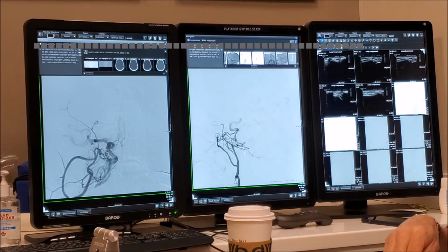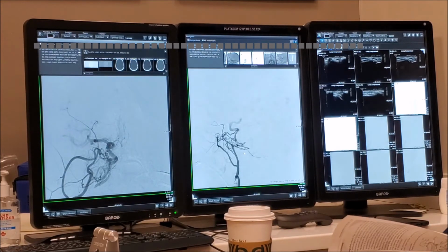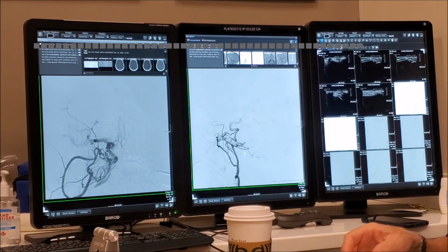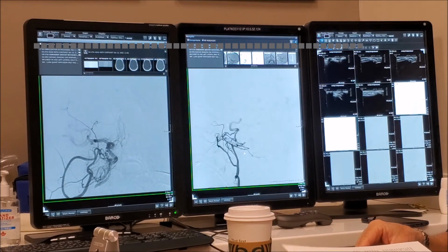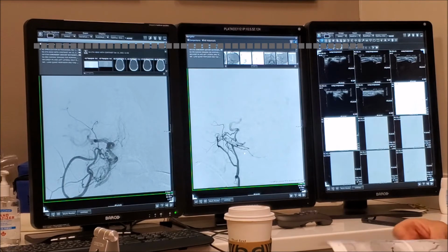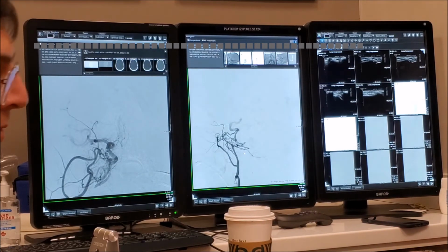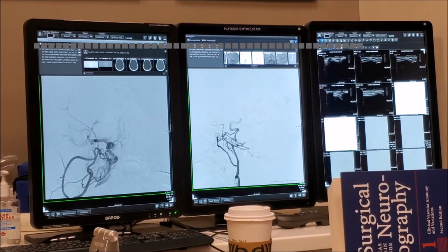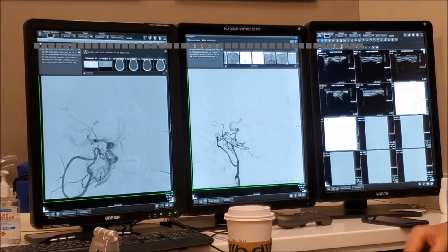Okay, no, but seriously, in here there's something, we're gonna be able to figure this one out. So the question was the stapedial artery. So please look for the stapedial, middle meningeal artery, stapedial artery. Okay, this is where we're gonna find the secret of what happened, okay? Very good. Okay, so I have to learn too.